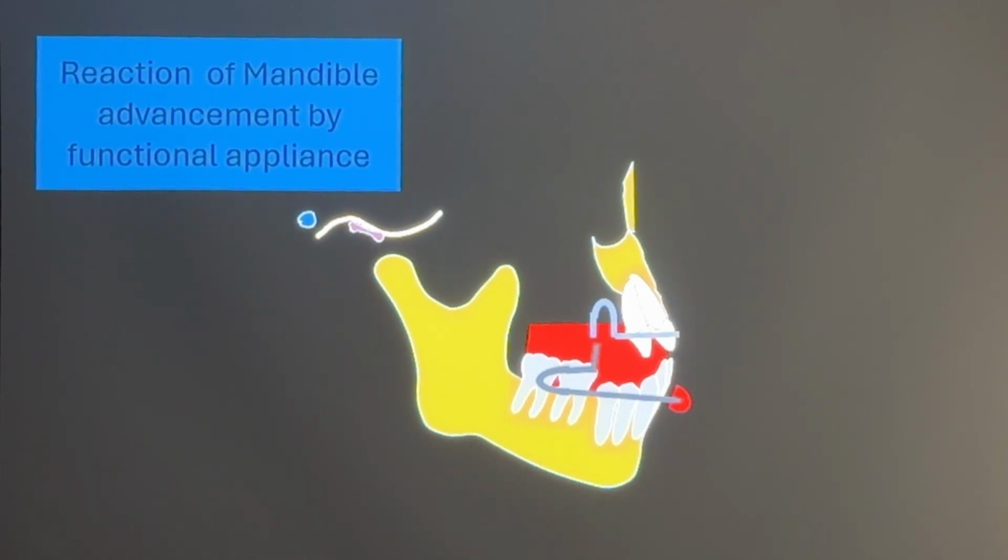Then apply it to the patient's mouth and check laterally. If you make a flat surface, it means you just keep their position there, just keep their alveolar bone growth there. But basically, in class 2, we need to promote mandibular growth. Mandibular growth at the TM joint and mandibular growth at the alveolar bone, posterior area, not the incisor area.